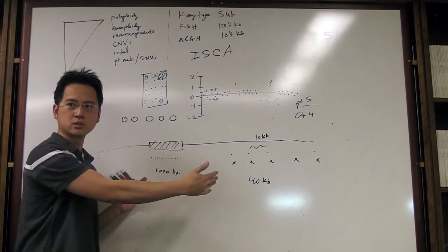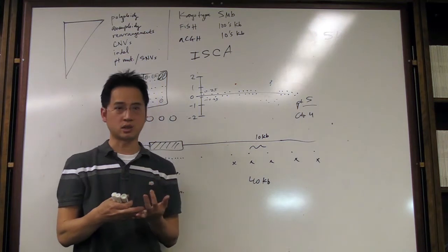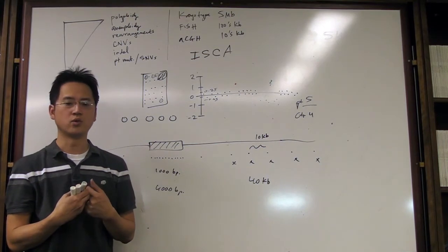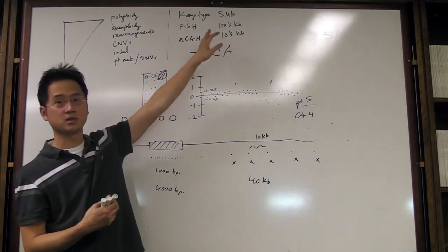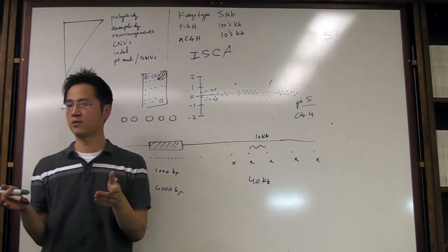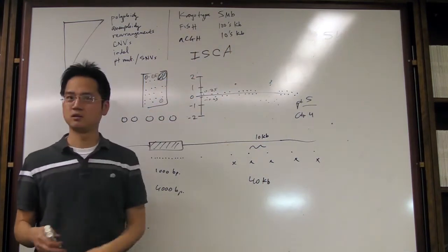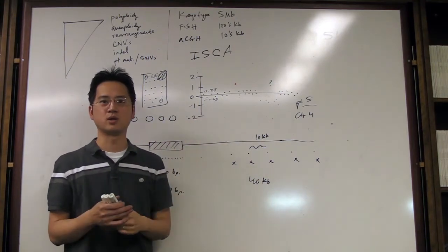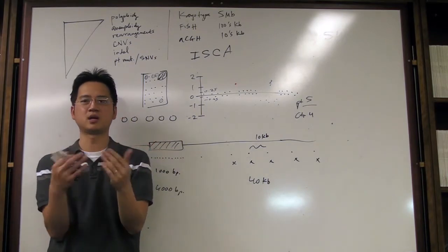But you sacrifice some resolution, but really, a lot of the diseases that we're detecting, which is autism, intellectual disability, congenital anomalies, these are pediatric cases that present with things that have basically gone through karyotype, gone through FISH. Because karyotyping, the resolution is very poor, may not be able to pick up, for example, a 2 megabase region that's affecting the patient. So you get a false negative there. FISH, you have to know what you're looking for, so you can't FISH for 500 different entities. That's just way too expensive to do. So they do something that they think the phenotype fits, but it comes out to be negative.